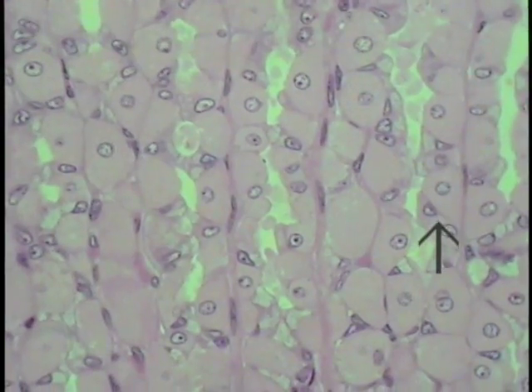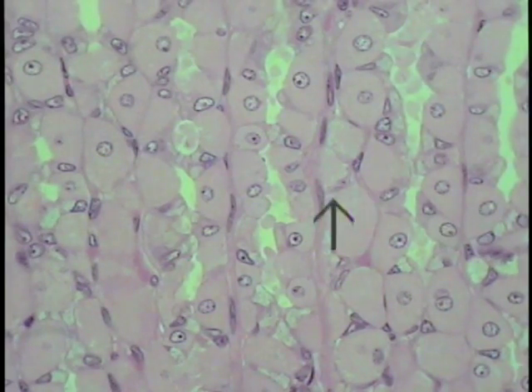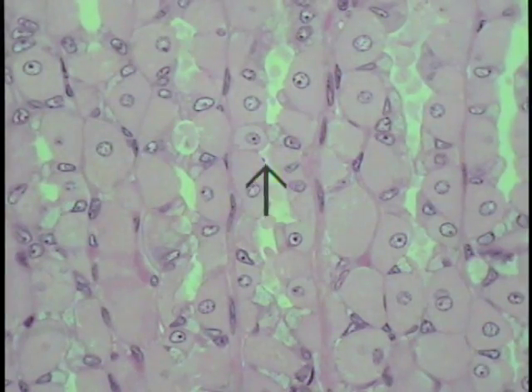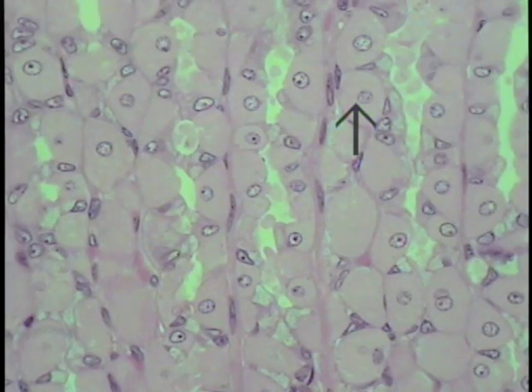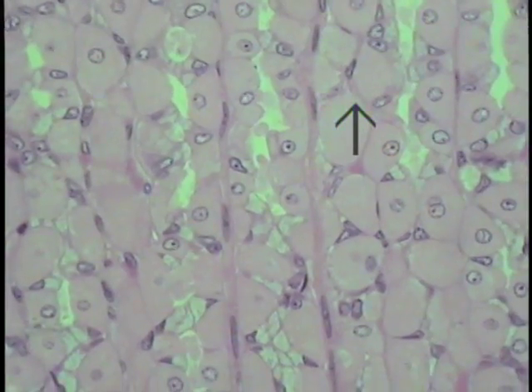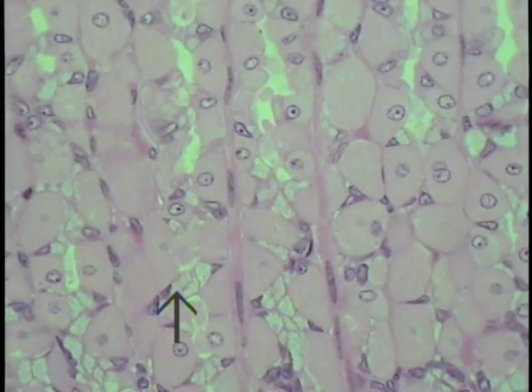Now, as we course down towards the bottom of the oxyntic glands, a variety of cell types can be seen making up the glands. These large cells with an acidophilic, or eosinophilic, background that bulge away from the lumen are the parietal cells. It is this cell type that produces the hydrochloric acid in the stomach, as well as gastric intrinsic factor in the human population. Cells such as this, with these frothy looking granules in this particular specimen, are the mucous neck cells.